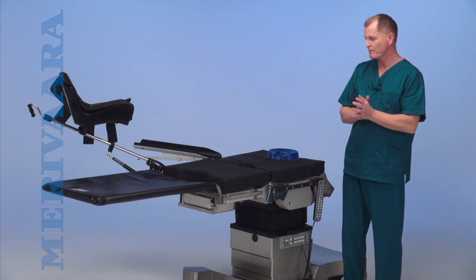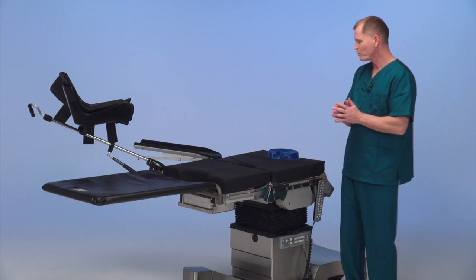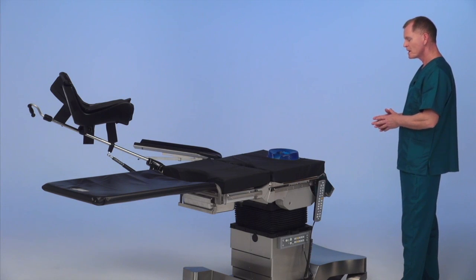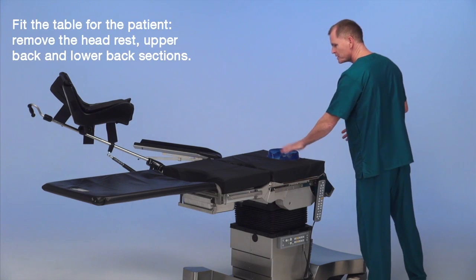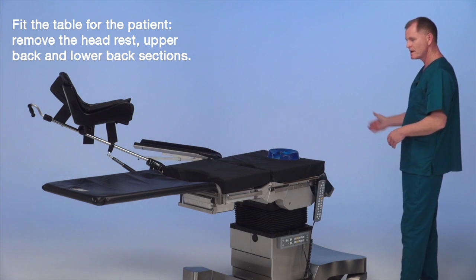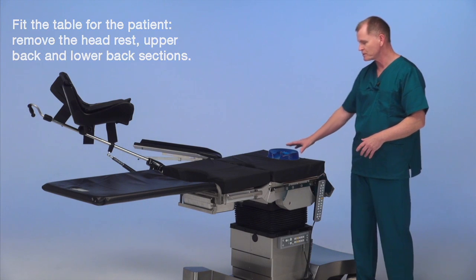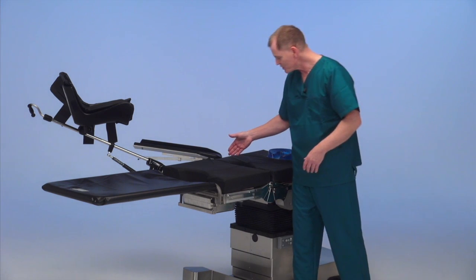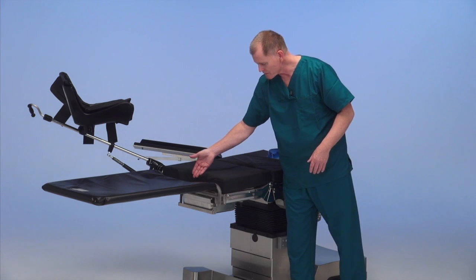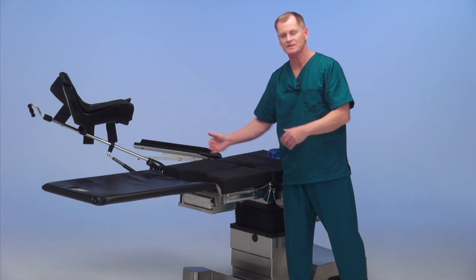We've set the table up for another lithotomy case — urology. We have removed sections based on the patient size. The patient's head will be here and she'll fit comfortably on the table. We removed the headrest, upper back, and lower back section to give good exposure to the head. The benefit of the two cutouts is we have the GYN cutout here and also the urology cutout here, built into the split leg section.